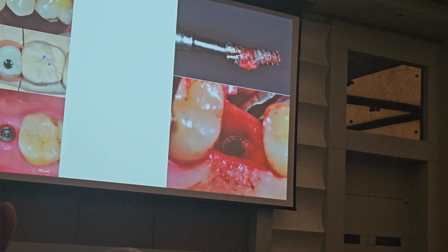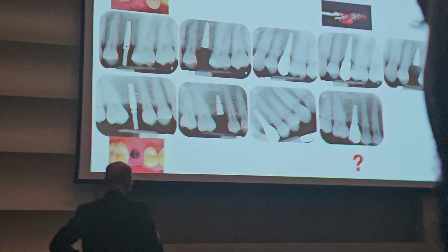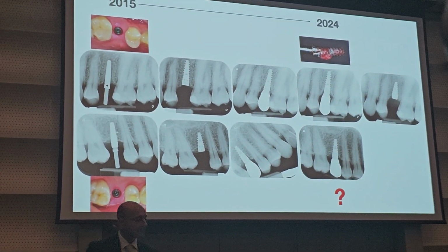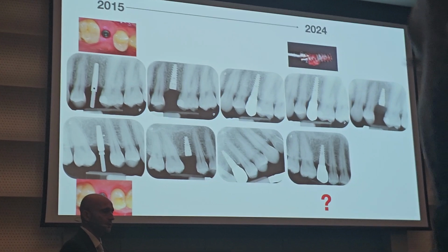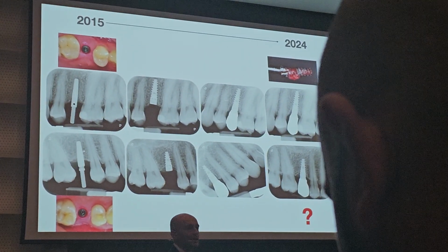And after 2 weeks, the patient said, I feel a little bit of pain even on the other side. So no, everything seems good, but this patient cracked. This patient spent all day standing this way. He had the means. But I made a mistake in this case. When you think that the patient is difficult, you have to create layers of failure. When you do a screwed crown in zirconia, where is the layer of failure? Always the screw, always the implant.